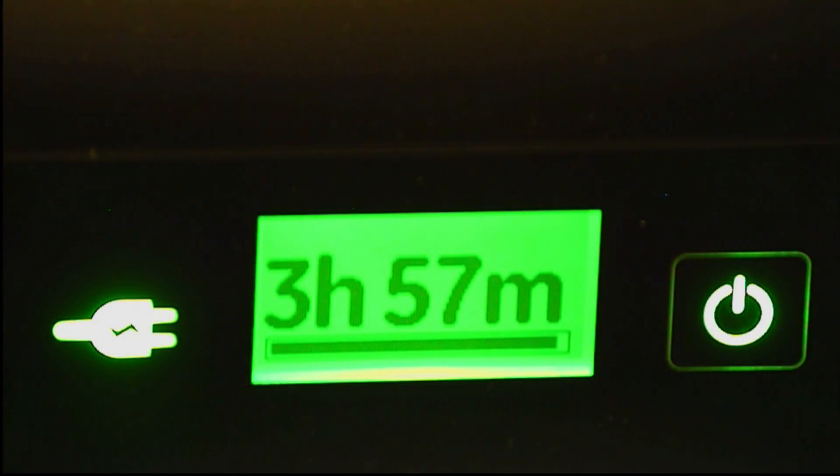Your battery indicator is located on the top right-hand side of your touch screen. On a fully charged battery, you will have up to 4 hours of battery life.